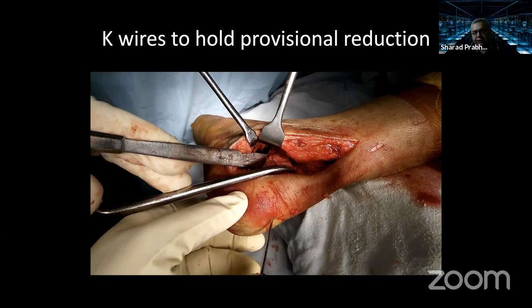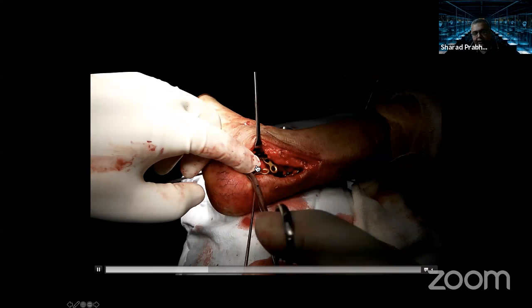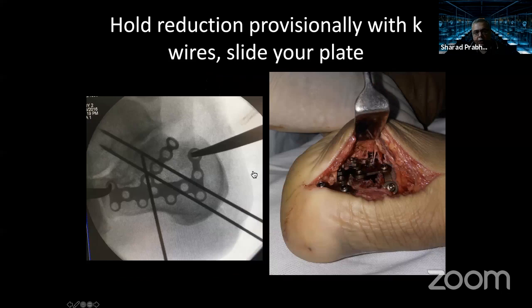We gradually evolved a second incision, which is right there. So this is where we are sliding a plate. This is one of the regular calcaneal plates that you can get; you can use any plate that you want. Once you've held your reduction temporarily, you check under your C-arm. The second incision lets you make a small vertical incision under the C-arm and use an artery forceps to go down to the bone, making sure that you have retracted your tendons away.